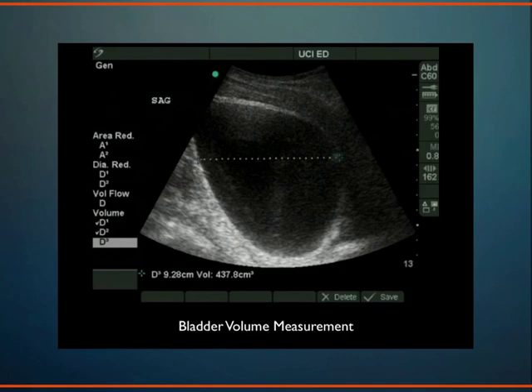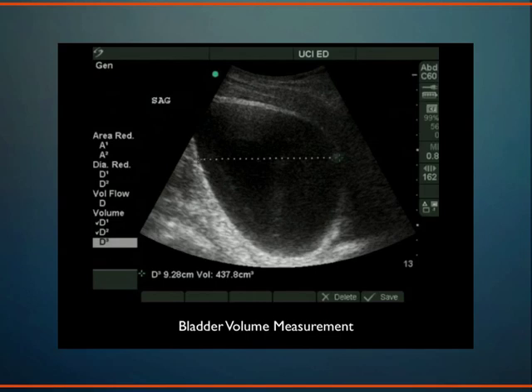This one had about 437 cc's in it. Why would you want to measure bladder volume? For example, in a child with a fever where you want to obtain urine for culture via catheterization — if they just urinated in their diaper, you would unnecessarily put them through a painful catheterization procedure. So nurses can take a peek at the bladder before bothering to put a catheter into a small child.